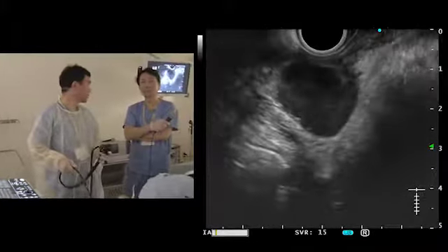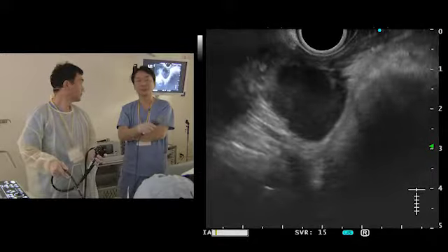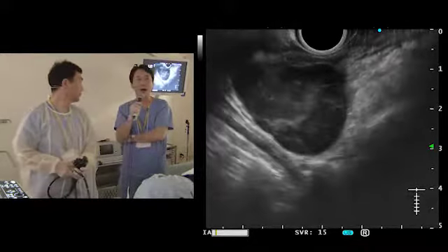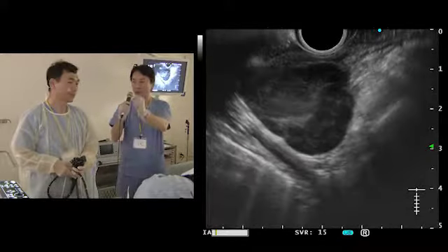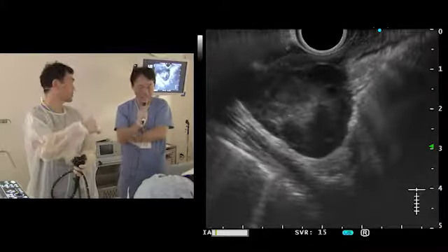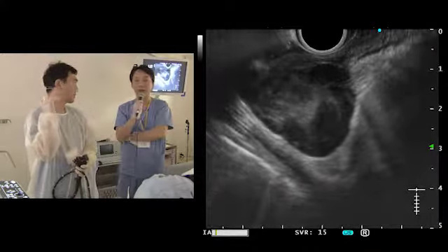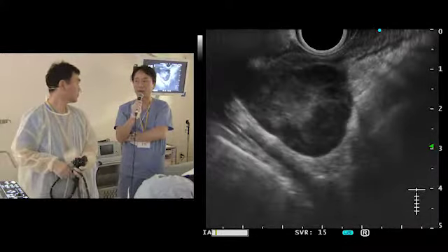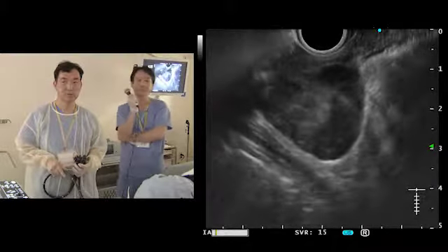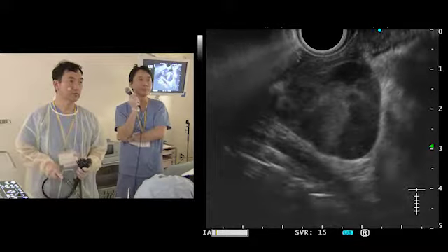How many passes would you do, Dr. Ryozawa? How many passes do you do? Is once enough for you? Yes, this is the first pass we have at least finished. Twice. Okay, you agree with that. Okay. Any other questions?